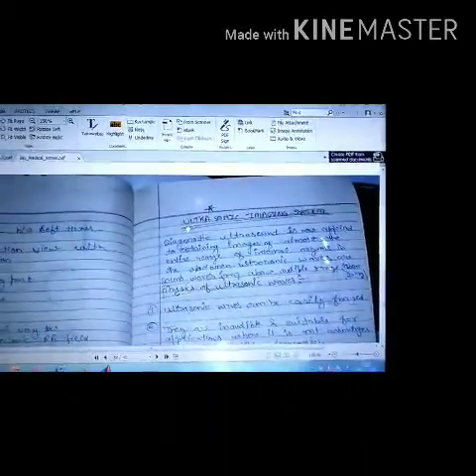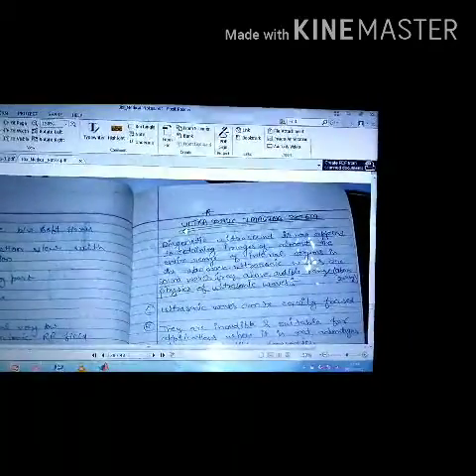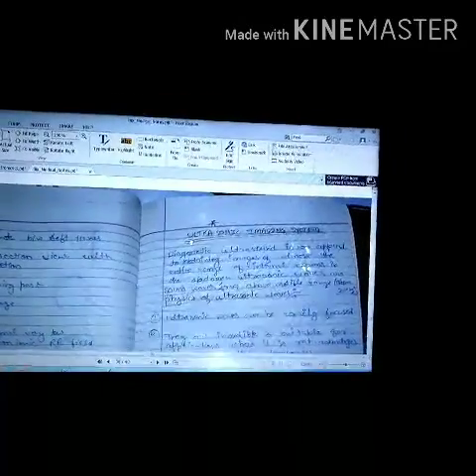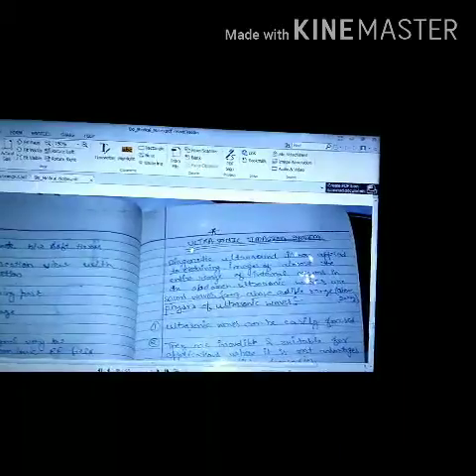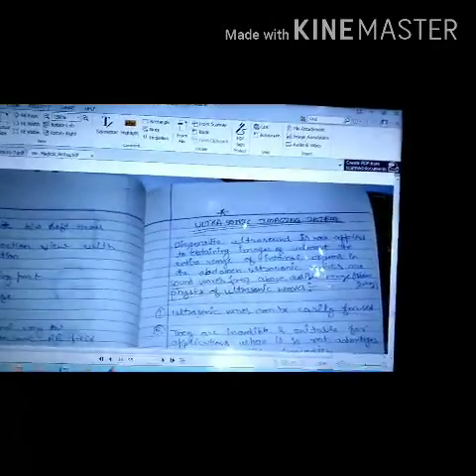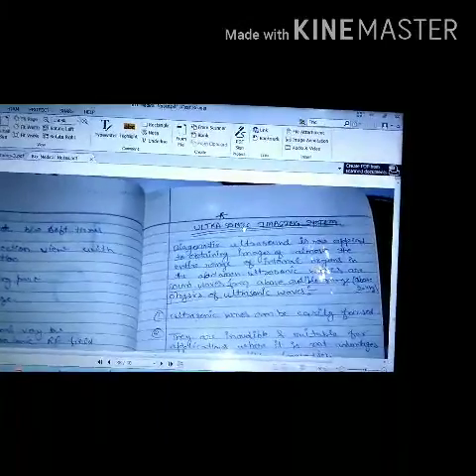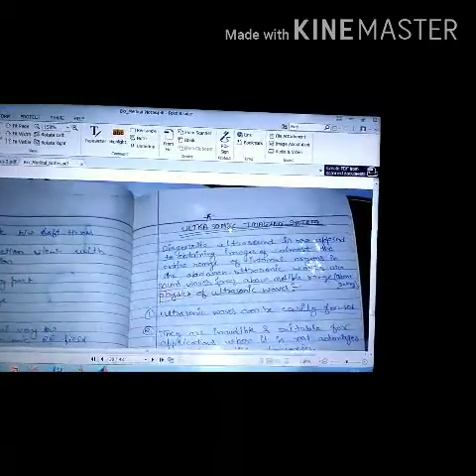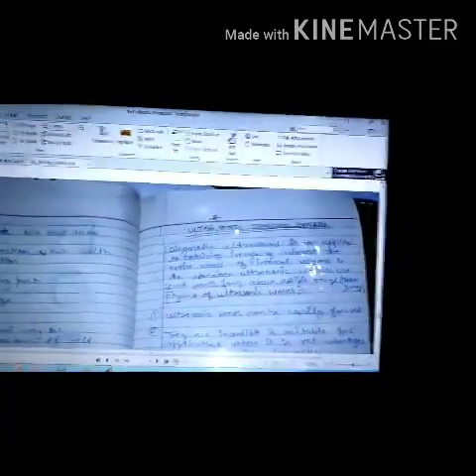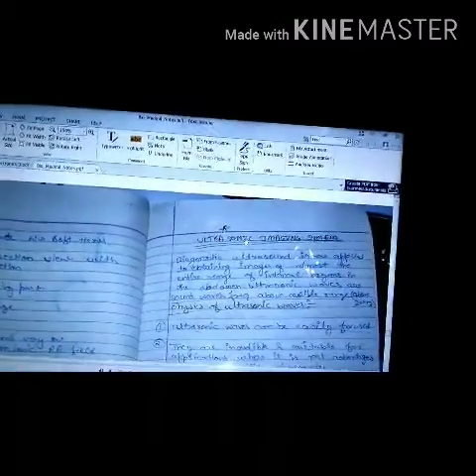Diagnostic ultrasonic is now applied to obtain images of almost all the internal organs in the abdomen. Okay, so just below our rib cage is our abdomen area, and the ultrasonic imaging system is utilized to observe and detect any deficiency or any discrepancies in the organs in the abdomen area. Ultrasonic waves are sound waves above the audible range. Audible frequency is in the range of 20 hertz to 20,000 hertz, that is 20 kilohertz.